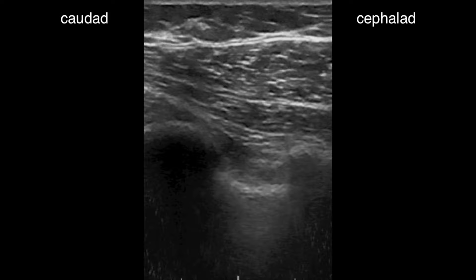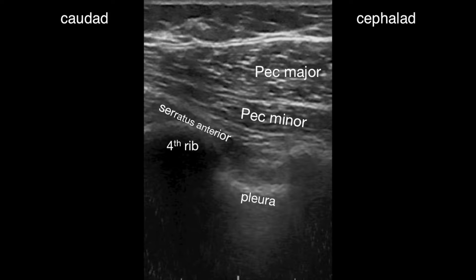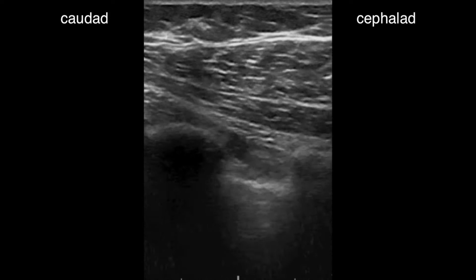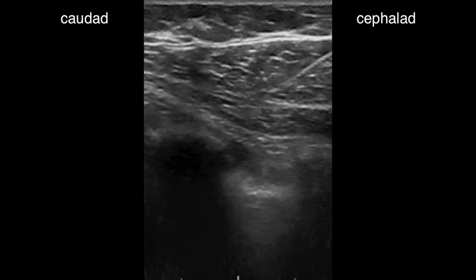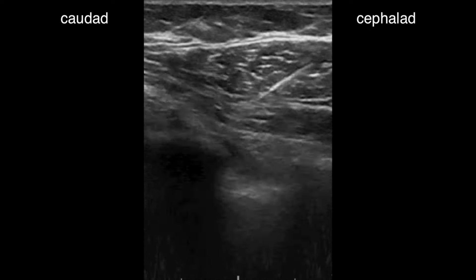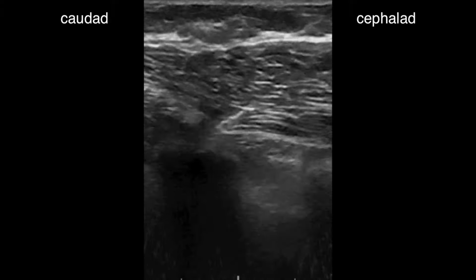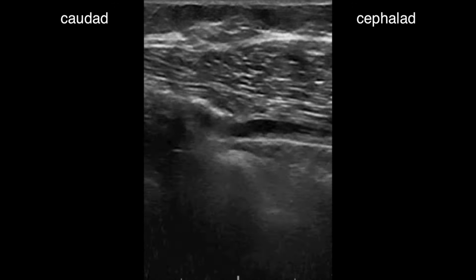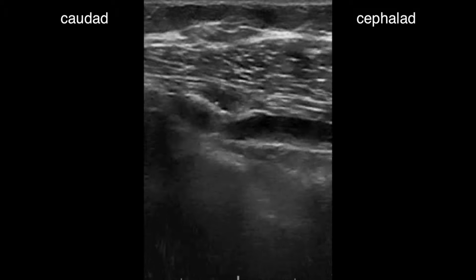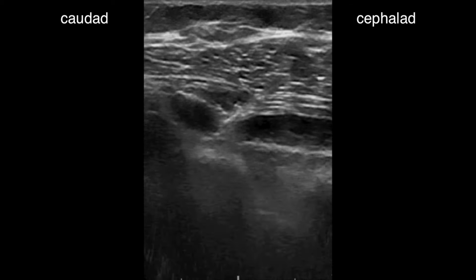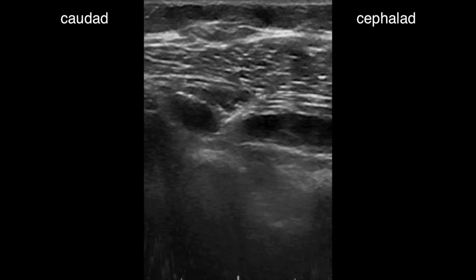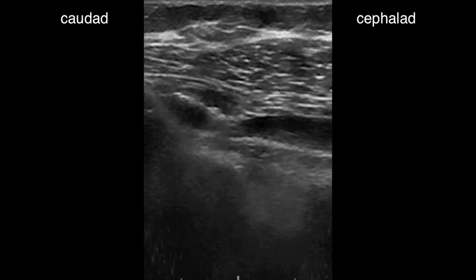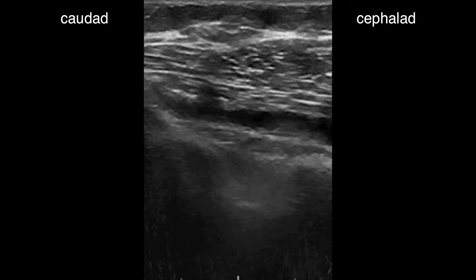Moving down a few centimeters, we now see the fourth rib, the two pec muscles, and the serratus anterior muscle. The needle passes through both pec muscles and then finds the fascial plane — you can see the two layers unzippering here nicely. This requires slightly more volume, and we find that 20 mils does the job. The choice of local anesthetic depends on the indication and desired duration of action, but in general these are small nerves and don't require a high concentration to get a good effect.